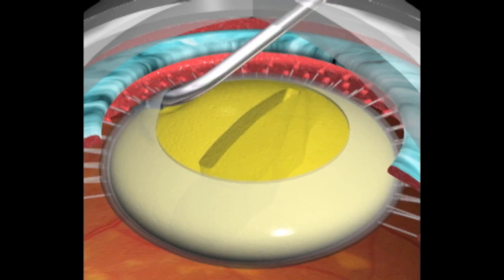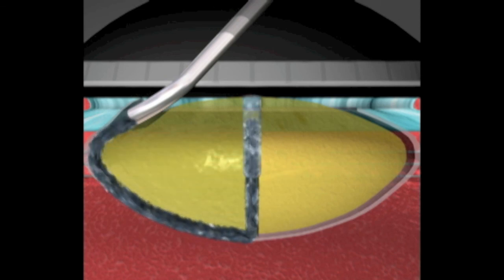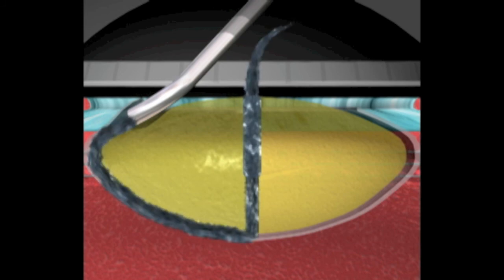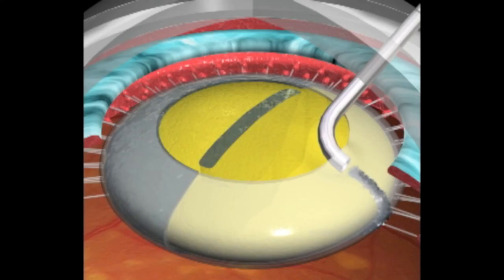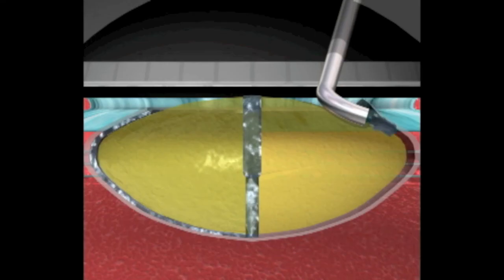After making the capsulorexis, we make a deep central groove in order to communicate the posterior capsule with the capsulorexis opening. We can see how the fluid flows in between the two halves, reducing in this way the capsular blockage and the possibility of posterior capsular rupture.